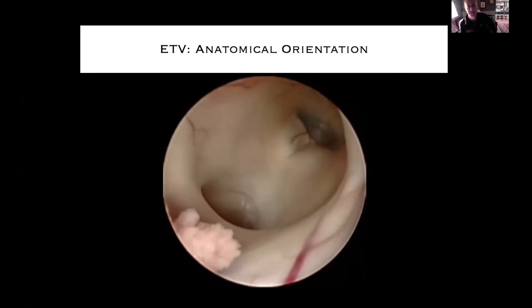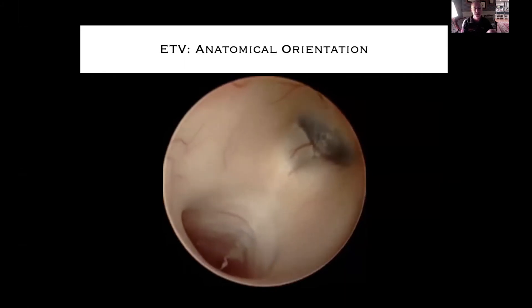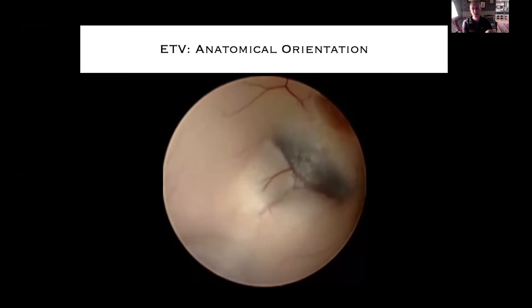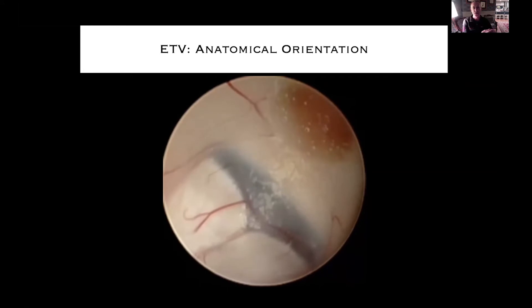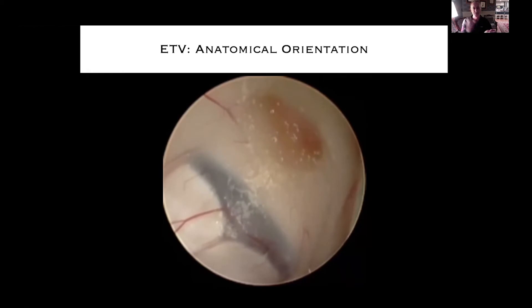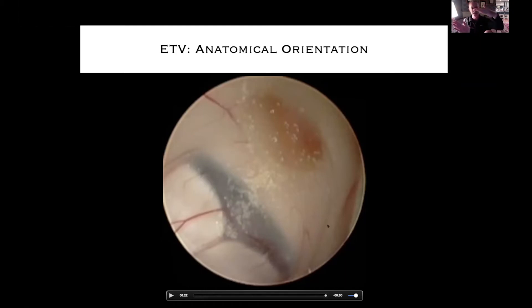This is a tumor biopsy ETV case. You can see the tumor at the bottom left at around seven o'clock. This is an interesting case because you can see stippling along the floor of the third ventricle, which is actually disseminated disease. The cherry-red spot in the front is where the infundibulum is, and here are the mammillary bodies. Even though there's anatomic distortion, you can tell that you're off by a good 60 or 70 degrees and you need to rotate your scope — getting orientation correct is the first thing you do.